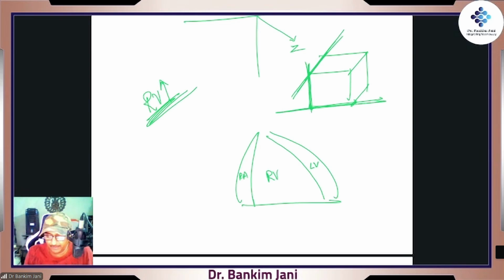The right ventricle, the leads which are kept in front, they will be watching it, correct? Because the right ventricle is in front. So if the lead is kept over here, they'll be straight away watching. That's why V1, V2 will be watching the right ventricle. So if the right ventricle is enlarged, the maximum signal will go to V1, V2, right? So they will be big.